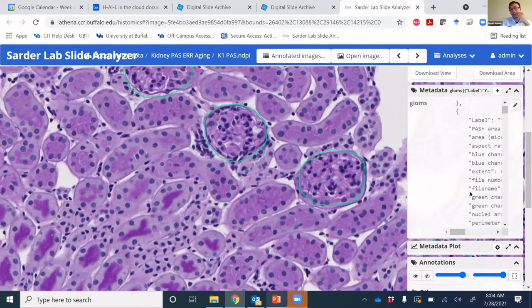And once we quantify those features, they are written in the metadata tag of this tool. When we talk about this metadata, it can include other information, like the subject information, what type of tissue this is, pre-analytic variables, sex, ethnicity, and all that information. So the whole idea of this metadata panel, which we are still improving, is there.